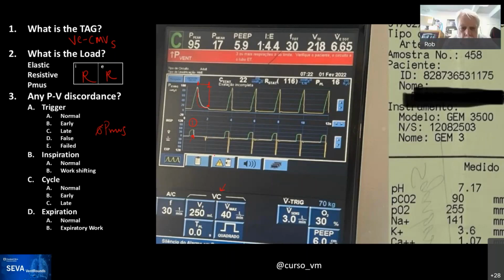Similar. And in general, there's two reasons for that exponential decay down to the plateau pressure. In the literature, they say one is stress relaxation in the tissues of the lungs, and the other is pendelluft, which is basically what you're saying. So you can have pendelluft between two lung units, or pendelluft between the patient circuit and the patient, right? Yeah, different time constants in the lung and moving air from one region to the other. Yeah.